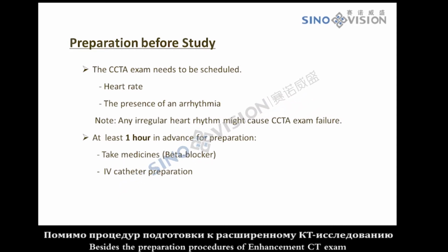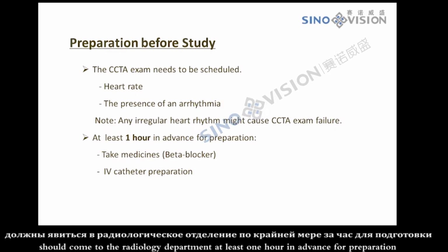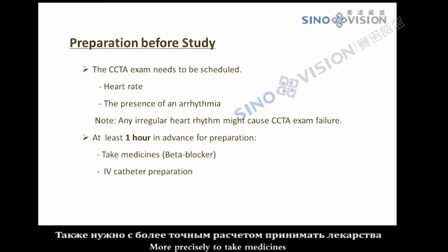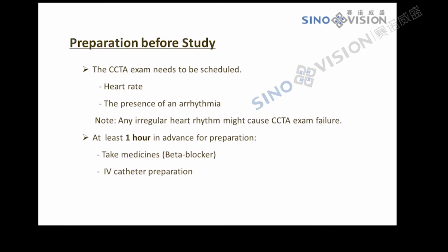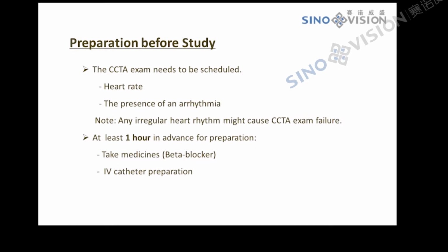Besides the preparation procedures of an enhanced CT exam, patients for a CCTA study should come to the radiology department at least 1 hour in advance for preparation. More precisely, to take medicines, to have the intravenous catheter inserted, and so on.